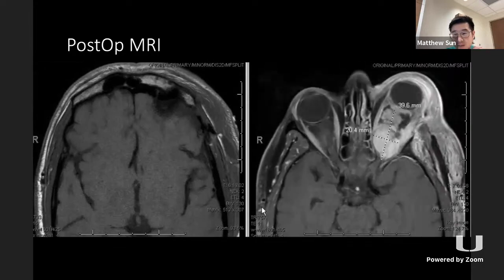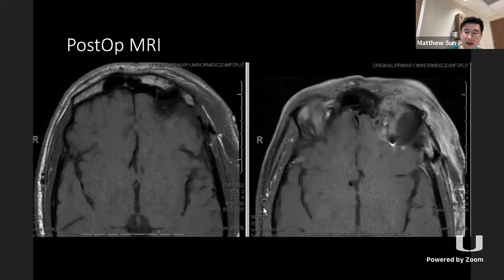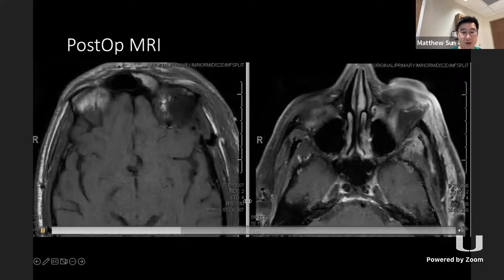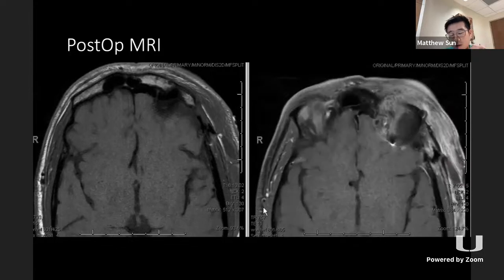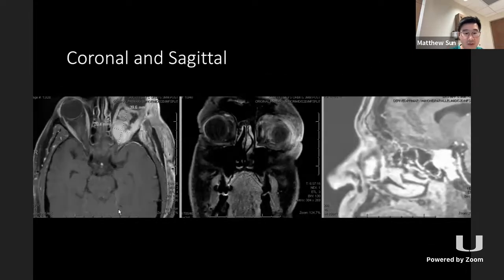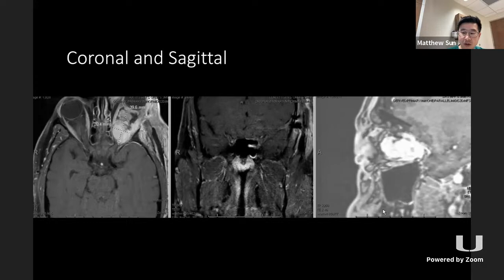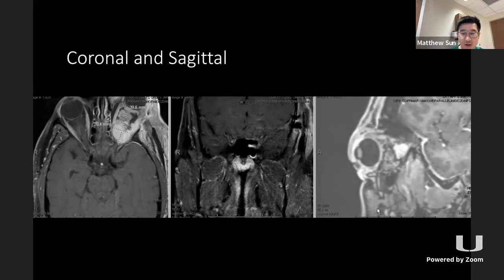Interestingly, postoperatively, there is actually a pretty significant residual on the MRI. As you can see here, the patient still has a fair amount of proptosis as well. Our oculoplastics team also did a fair amount of resection. They felt that a complete piece of tumor, which was very fibrous, very tough and adherent, was resected. As you can see even on the pre-op MRI, there are some septations on the contrast and T2 sequence imaging. So perhaps there were two separate lobules of this tumor, and one of them was resected. Here's the coronal and sagittal of the residual. At this point, I was wondering, for the panelists, what would you do at this point?